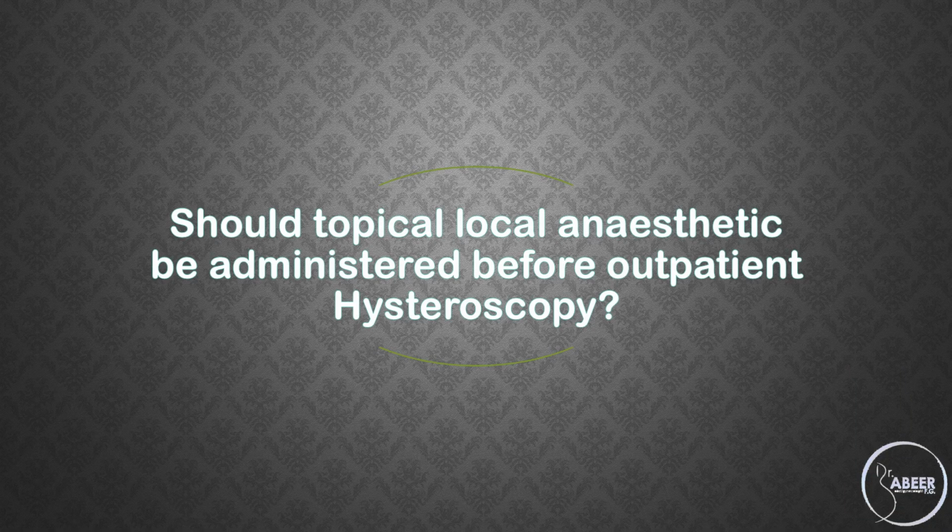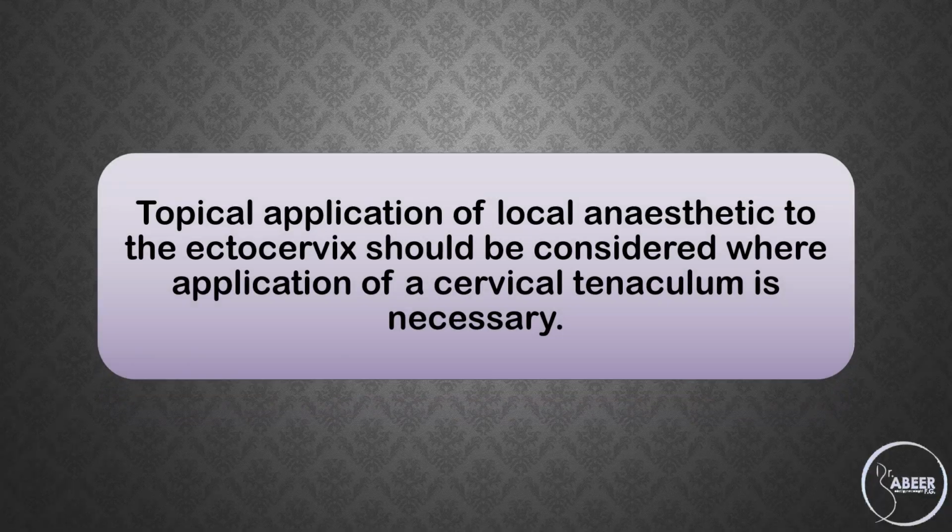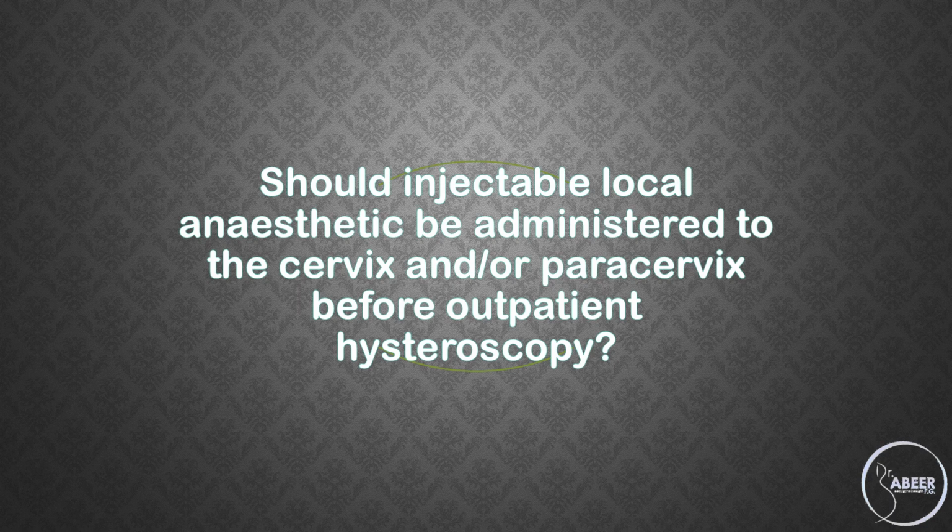Should topical local anesthetic be administered before outpatient hysteroscopy? Instillation of local anesthetic into the cervical canal does not reduce pain during diagnostic outpatient hysteroscopy, but may reduce the incidence of vasovagal reactions. Topical application of local anesthetic to the ectocervix should be considered where application of a cervical tenaculum is necessary. Should injectable local anesthetic be administered to the cervix and/or paracervix before outpatient hysteroscopy?